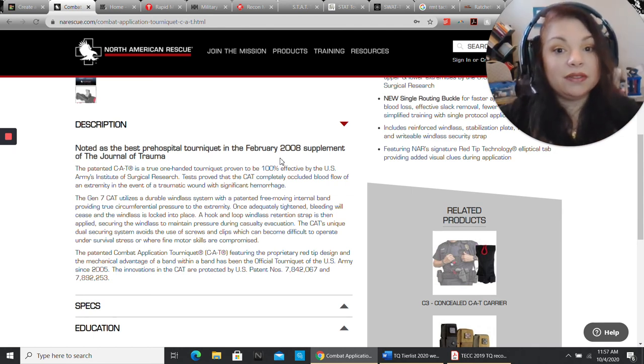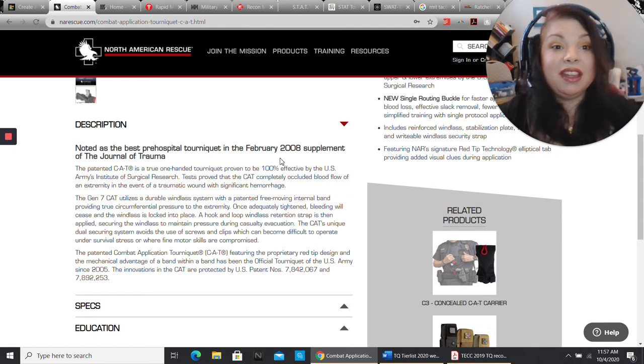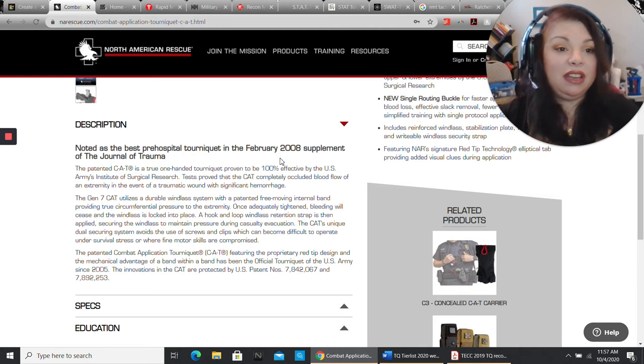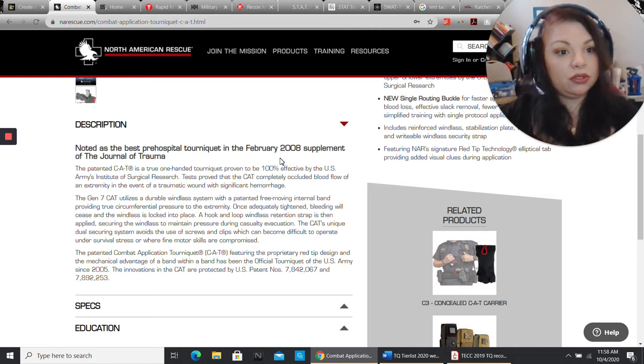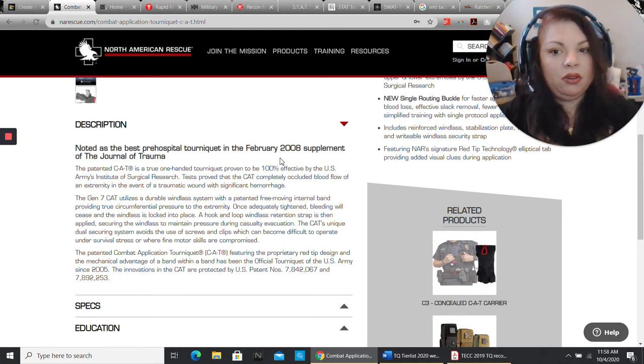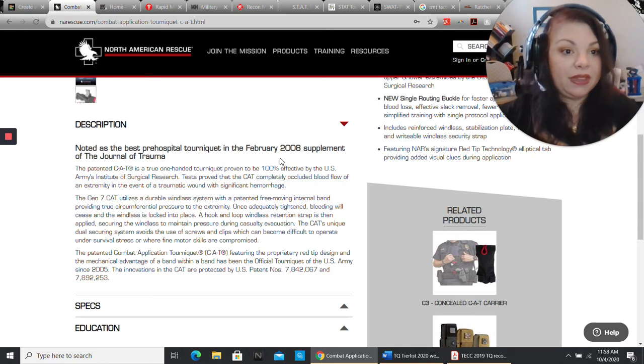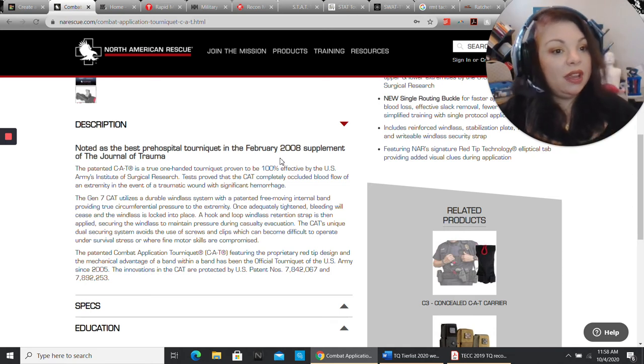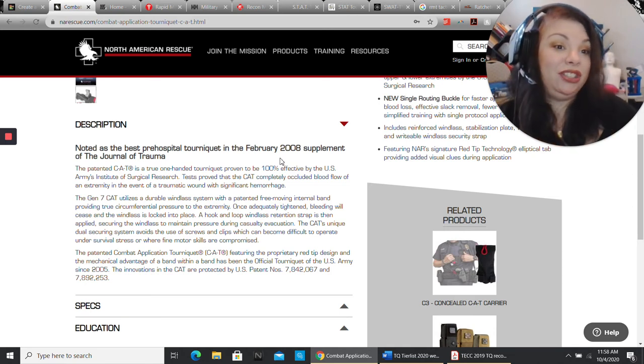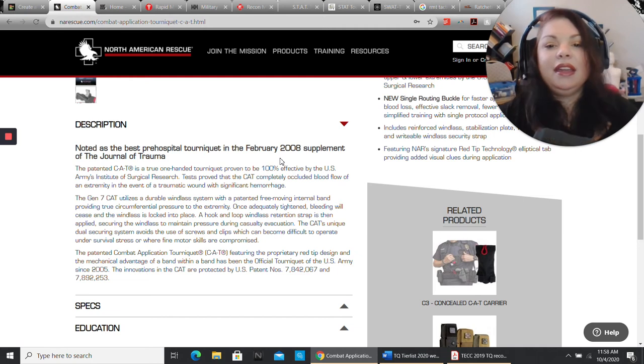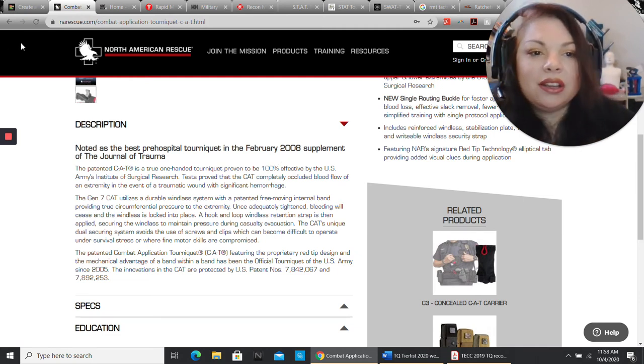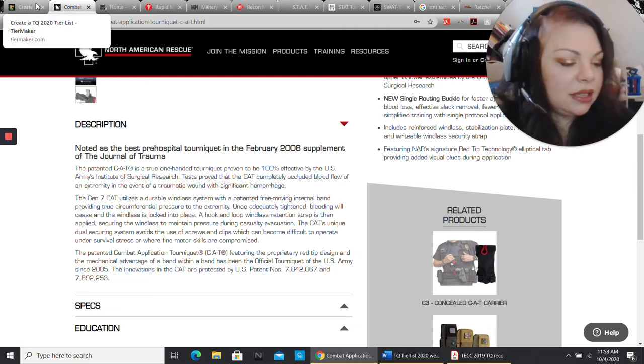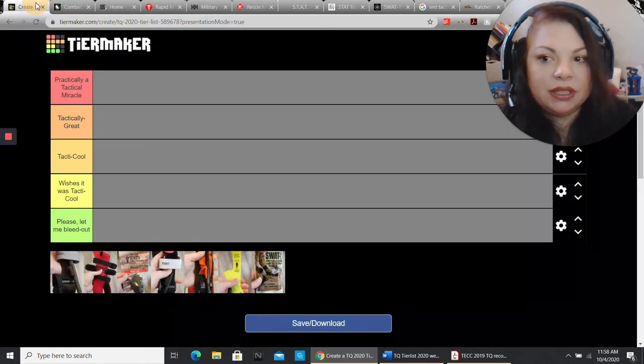Is it effective? Yeah, it is effective. Even in the NAVSEA, it was over 90% for upper extremity, and it was a bit over 75% or 80%, if I recall correctly, for lower extremity. So it was really good. It did its job. So the cat does what it's supposed to do. It's a good tourniquet. It's a solid choice.